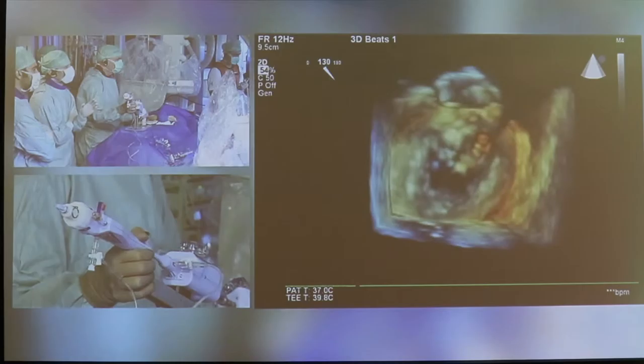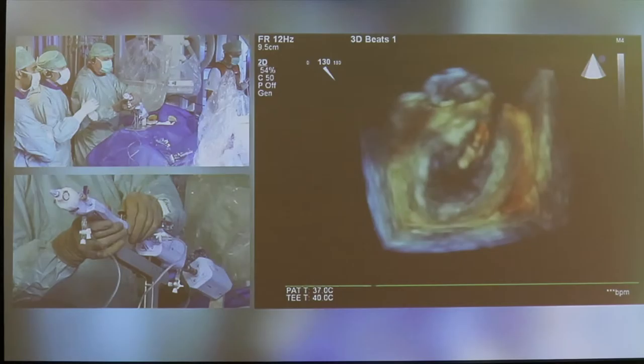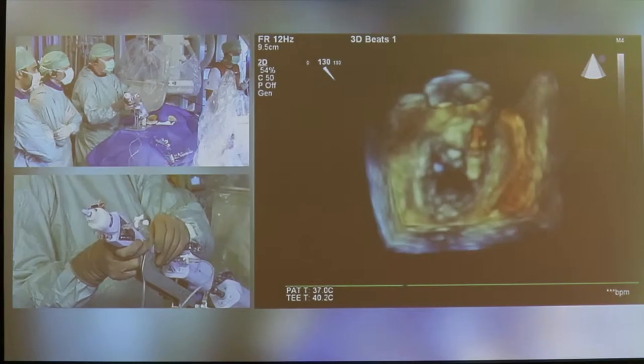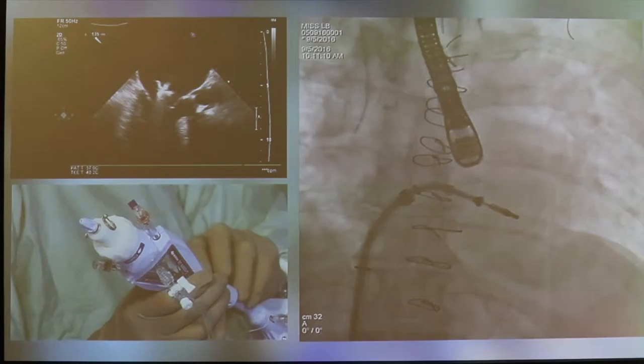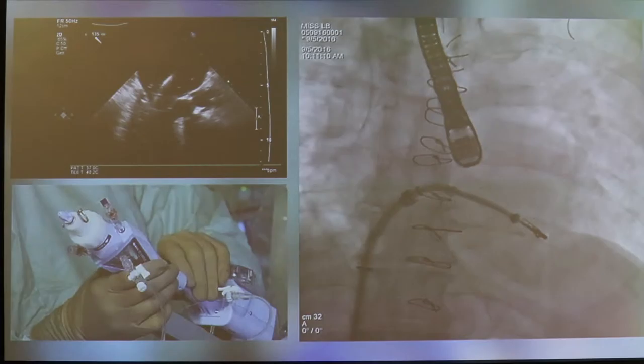We first aim for perpendicularity from the clip to the coaptation line, so we need to go counter-clockwise, and maybe a little posterior as well. We can correct for that later. I try to go across the valve, and we actually saw that the clip was visible during the entrance — a sign of not going too much out of plane.